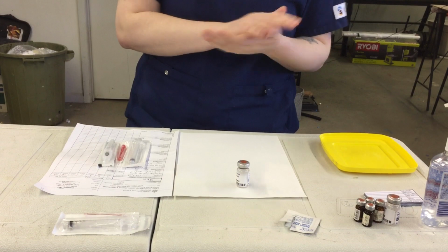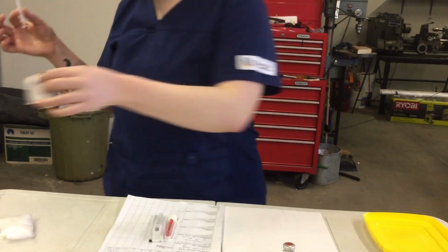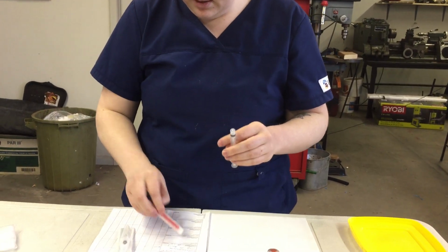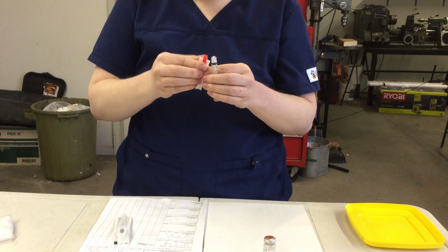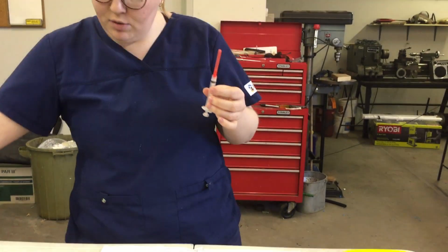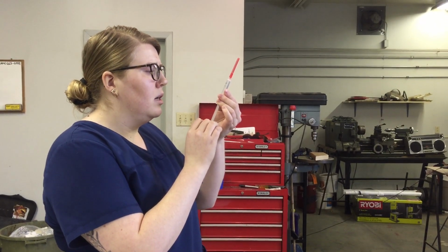So after I've done that, I'm going to wash my hands again, and I'm going to get my syringe ready here, making sure I'm not breaking any of the sterile aspects of this syringe. I'm going to open my blunt fill needle, making sure not to break the sterility of any of the sterile aspects. I'm going to throw that in the garbage. So at this point, I'm just going to draw back my 3 mLs.